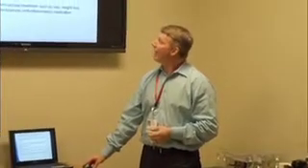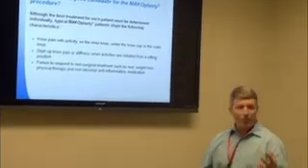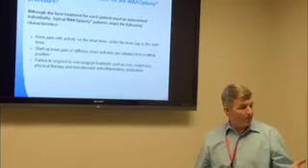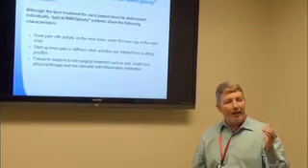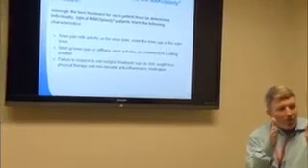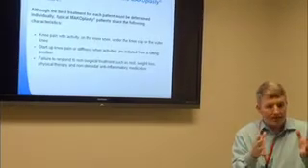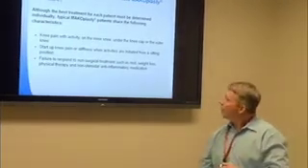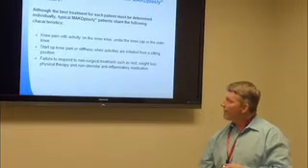So who would be a good candidate for the Makoplasty procedure? As I said earlier, each treatment is going to be individualized, so not everyone is a candidate. This is a great technology, but there is a specific window of patients with specific arthritis that are candidates. Not everybody's a candidate. Some findings are consistent with patients that are usually a candidate.